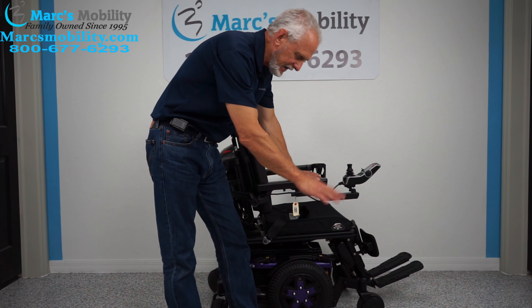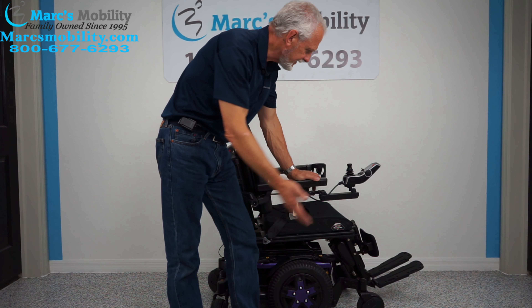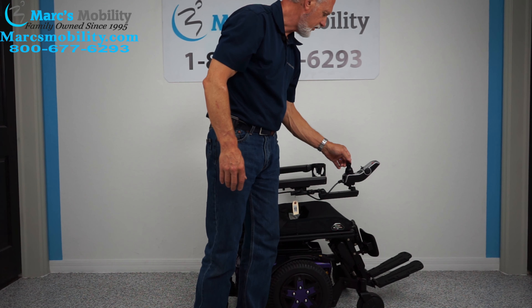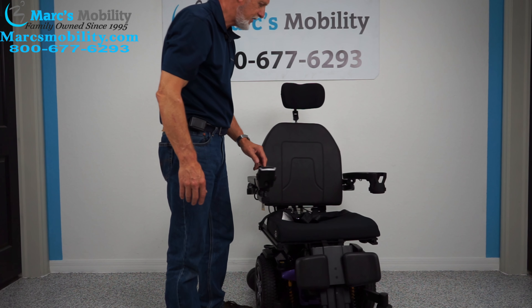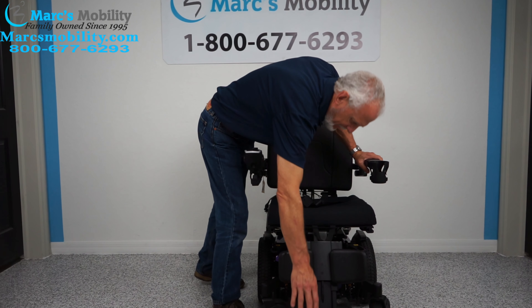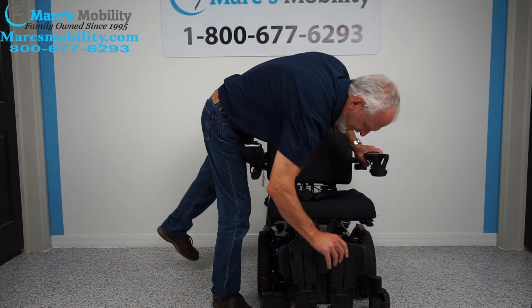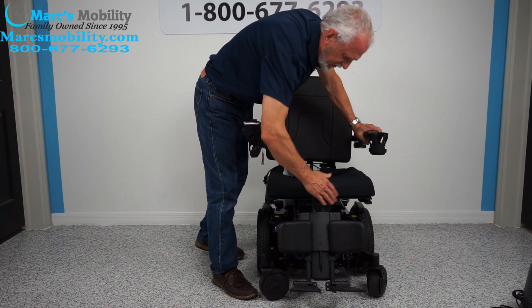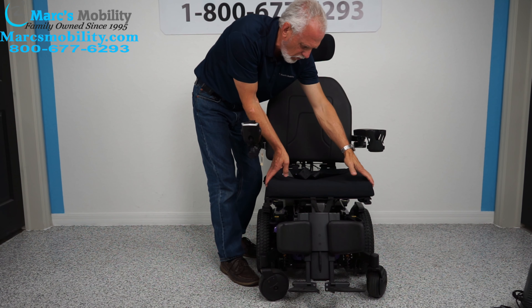So far we've covered the electric tilt, the electric recline, and the electric feet. I'm going to put it back in drive and turn the chair forward so you can see the front. This chair has calf pads. These foot plates flip up when you exit because when you exit you're going to want the legs all the way in so everything is flush. The seat is 20 by 18 — 20 inches by 18.